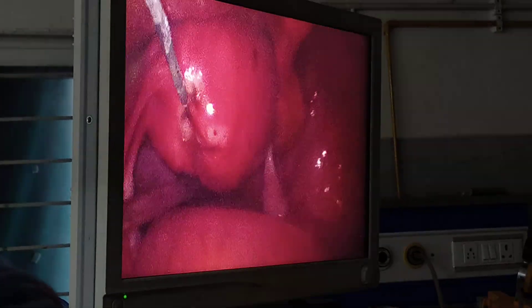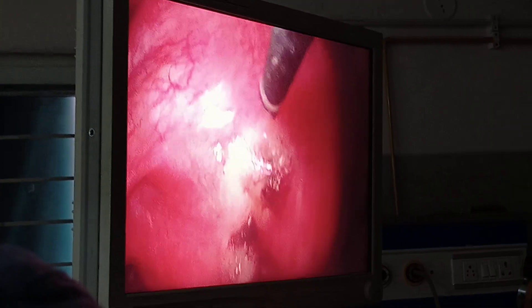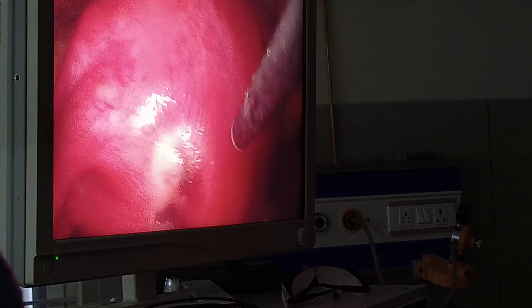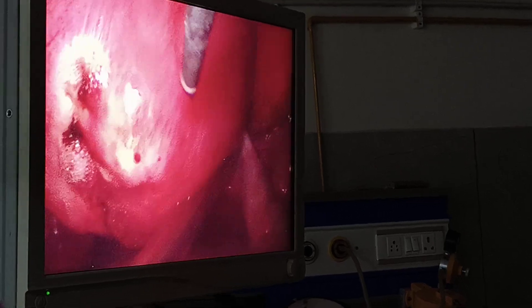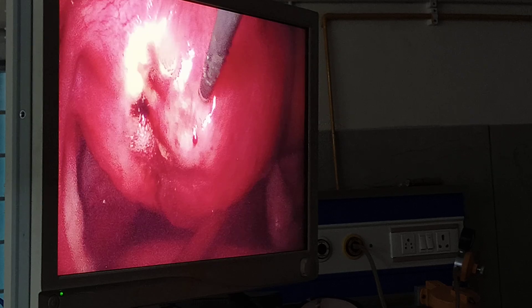Camera check — we have come back, there is no bleeding from the entry point. This is the beauty of thermal ablation, microwave ablation. We will take — this is another — you see shrinkage from this side. This is the pathology remnant. We will take from here.